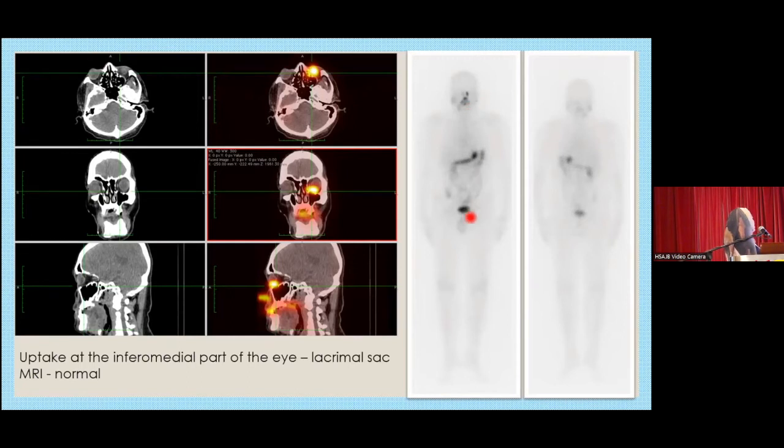Another benign image, as you can see here, out of the blue, this patient turned out to be physiological. There's no disease, but there's something in the oropharyngeal area or slightly above it, which likely could arise from the eye, and true enough, from the SPECT-CT, it is actually uptake in the lacrimal sac. We asked the primary team to further investigate, and the MRI turned out normal. Iodine can be taken up in the lacrimal duct or lacrimal sac, which is obstructed, or in this case, it's not.